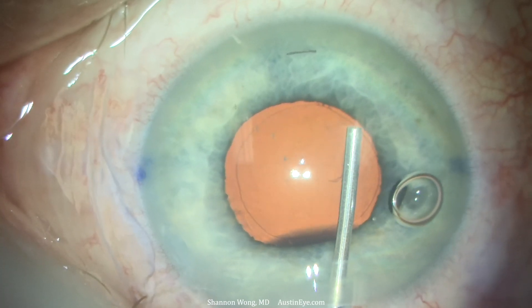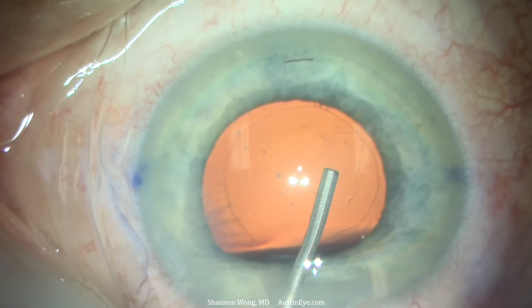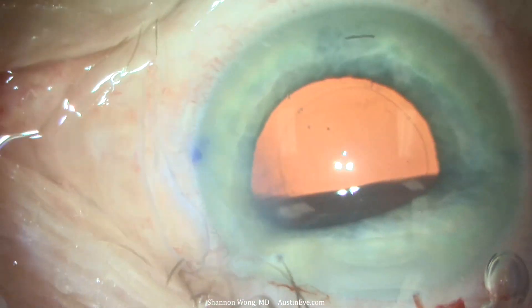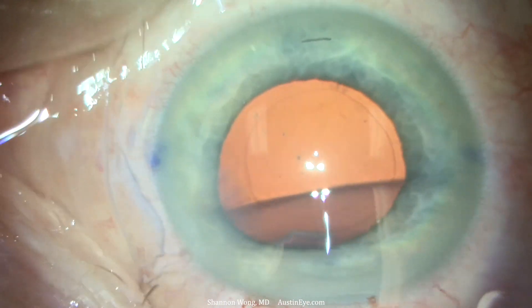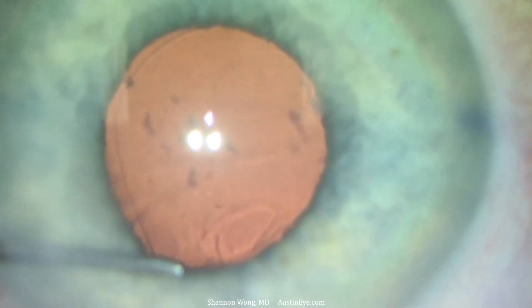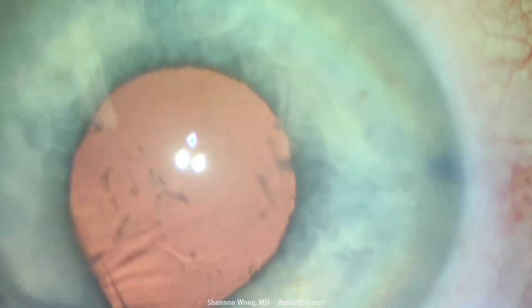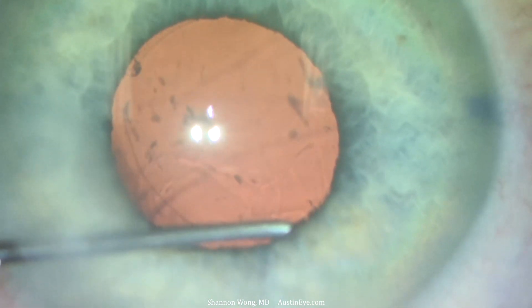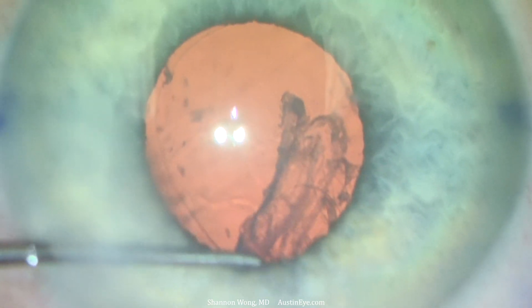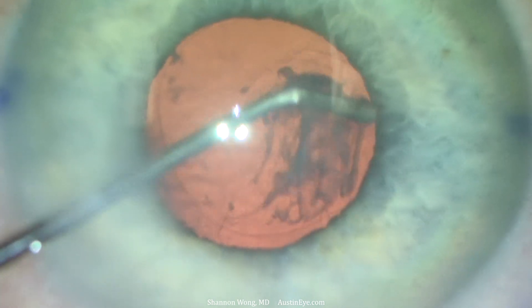Now that we've cleaned the capsular bag, we use viscoelastic to expand the pupil. We want to see where the femtosecond laser cut the capsule relative to our manually created capsulorexis. We also use a Singer sweeper made by Epsilon Instruments to polish the posterior surface of the capsule closest to the primary incision, and we discover a sub-incisional cortical remnant that we can now remove.